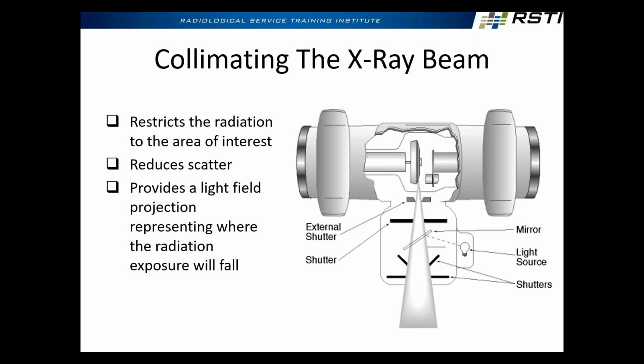Like, no, you've got a technique chart right here. It's by law, you've got to have one. Just use that. We don't do that. We just say what we want and it does it for us. All right, because that's one of the downsides of that advancement, is as they come to rely on it more and more, they forget how to do it.